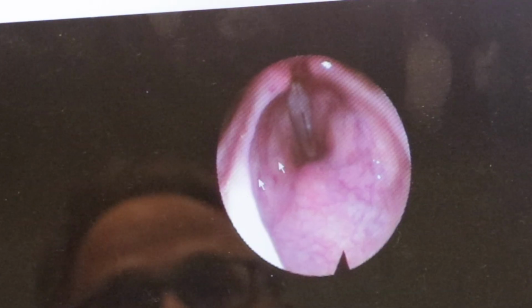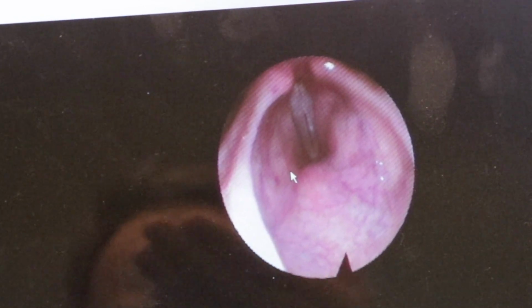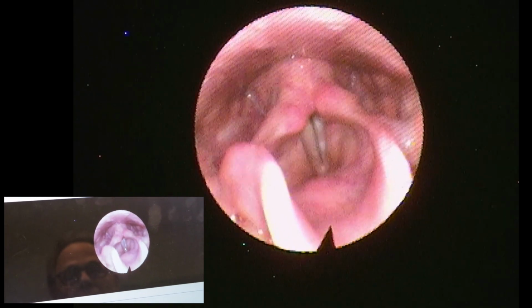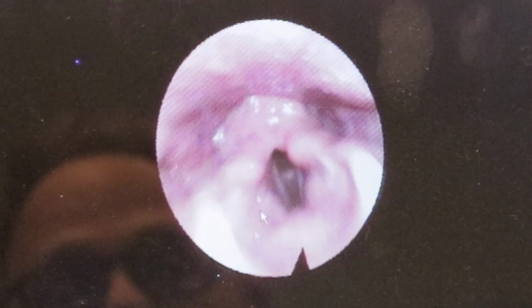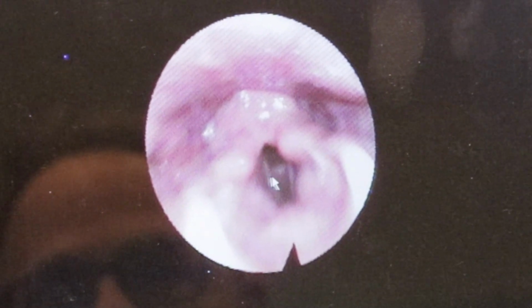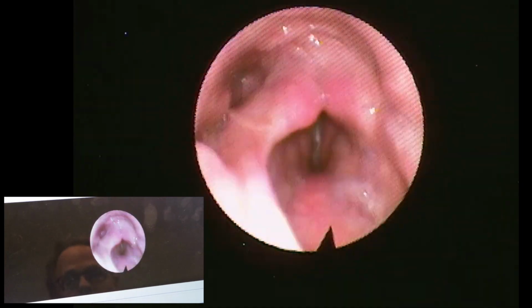Glissando. Once again, as you got higher and higher, these aryepiglottic folds become thinner. Your epilaryngeal tube gets narrower, which raises your voice, raises your pitch. So right now you're engaging your false vocal folds. You're doing the grr, the gruff, and so you're making a lot of that sound with your false vocal folds and these arytenoids that come forward, as you'll see them come forward. Oh, so the arytenoids even help with creating that. They fold forward. See how they're folding forward?